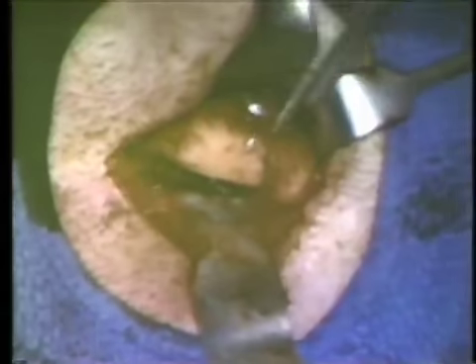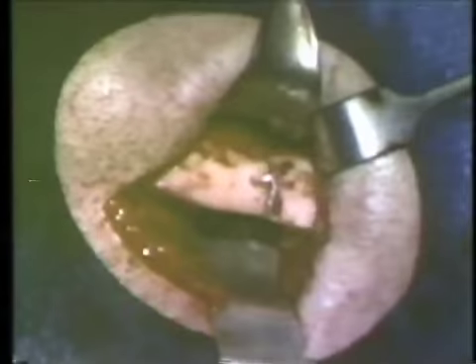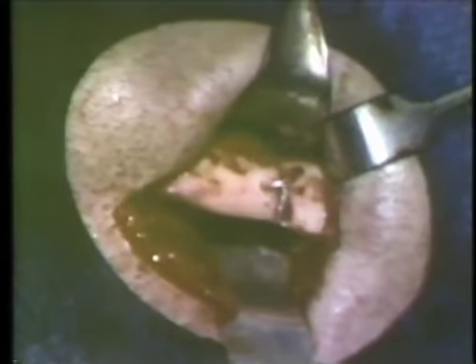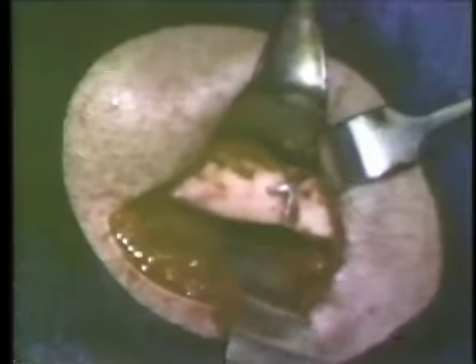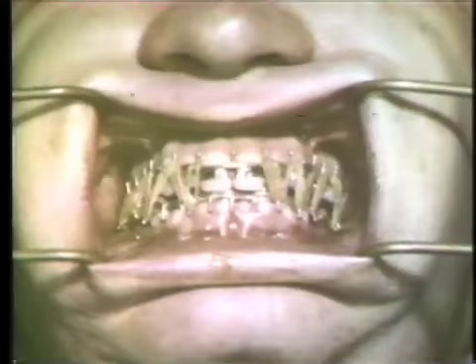The insertion of drains has been something else that now is no longer customary or required. Purposes of drains are pretty much limited to evacuation of infections and evacuations of hematomas. With reasonable care, the quantity of bleeding in these sites is quite limited, and with pressure dressings, things heal without the need for drains. In this rather long procedure, the edema in soft tissues is rather extensive. You'll see that that will be gone in a follow-up.